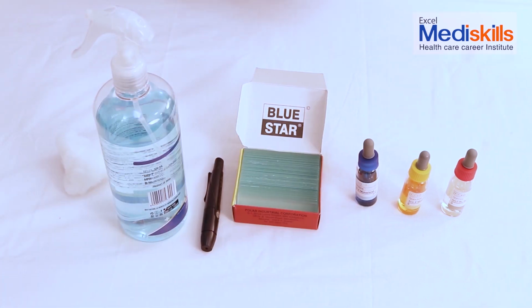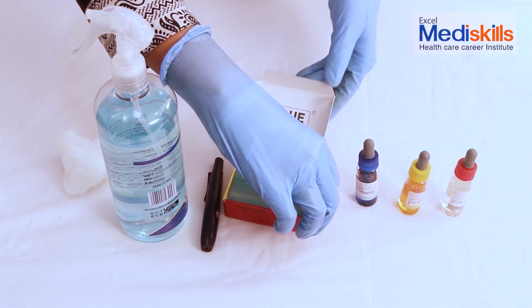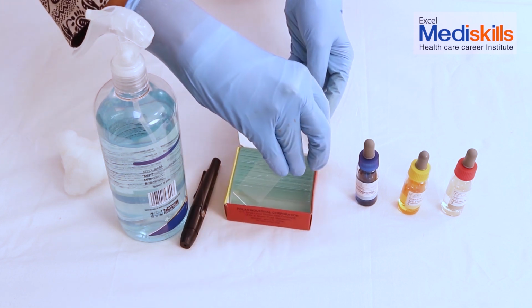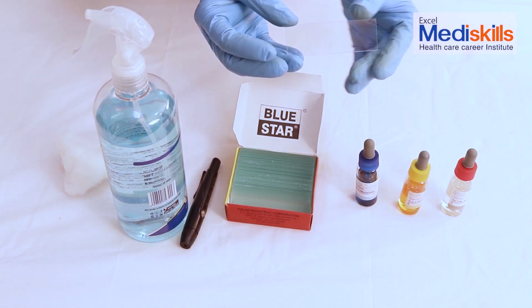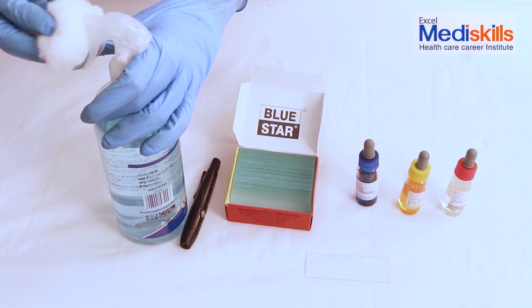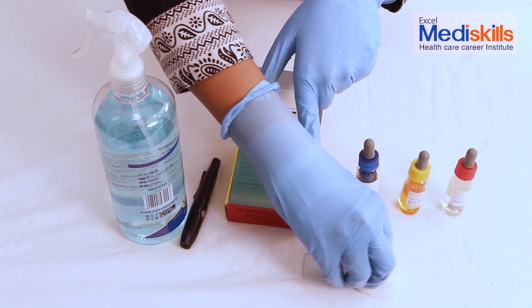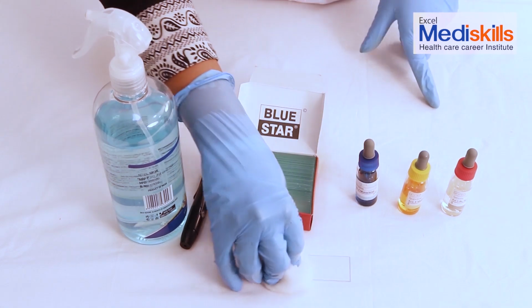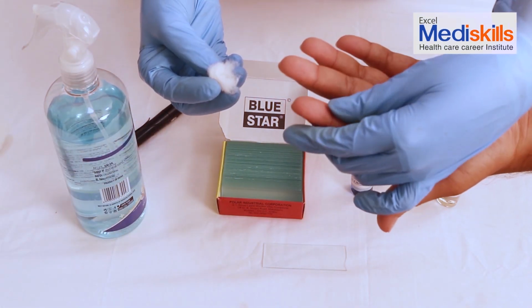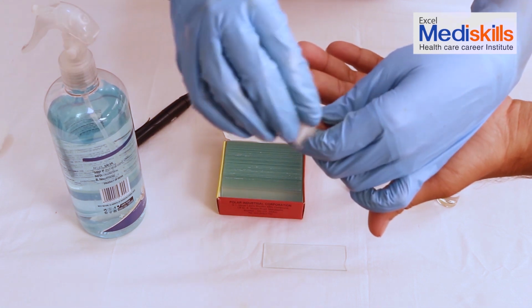At first, we will take out a glass slide from here. Remember, you have to pick up the glass slide only by holding the sides. Never hold the glass slide in the middle. In the next step, we will sterilize or disinfect the top part of the glass slide with cotton. First, we will disinfect the tip of the patient's finger.